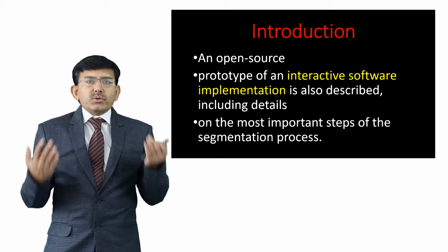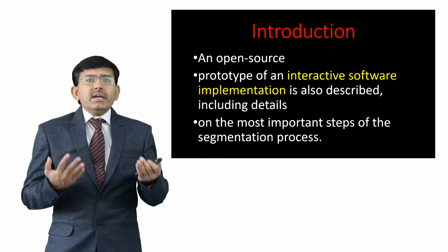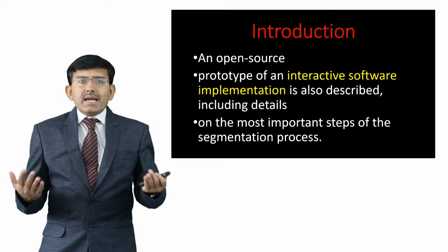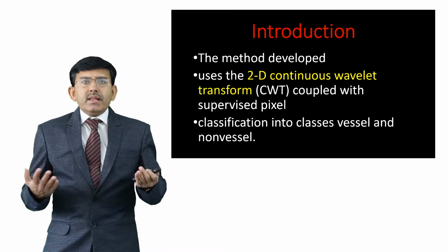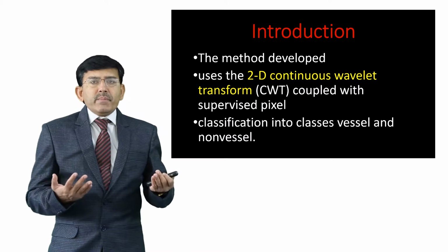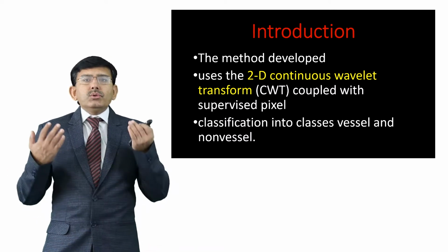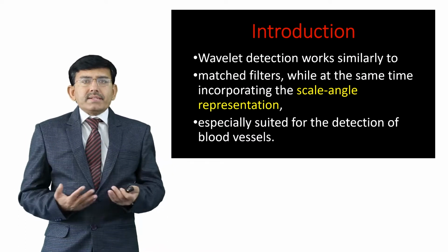An open source prototype of an interactive software implementation is also described well, including details on the most important steps of the segmentation process. The method developed uses the two-dimensional continuous wavelet transform, that is CWT, coupled with supervised pixel classification into classes of vessels and non-vessels.